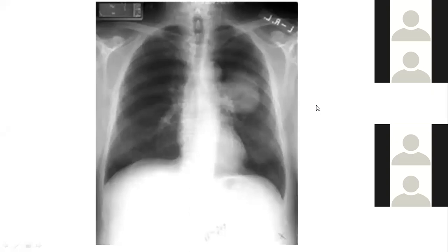Yeah, if you have typed broad base, silhouette sign, hilum overlay sign. After seeing so many X-rays over the past few years of my becoming a radiologist, what I have realized is that the basic essence is the same: a lung mass will form acute angles with the lung itself.